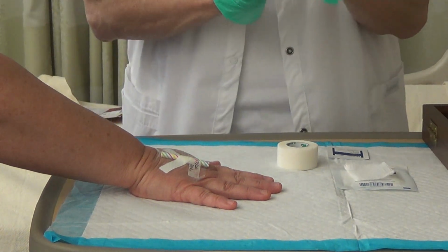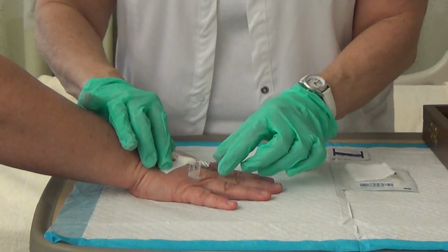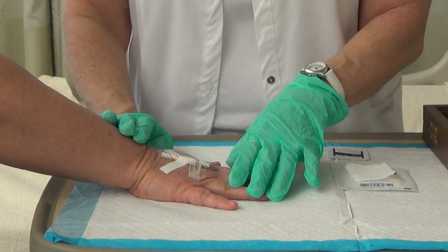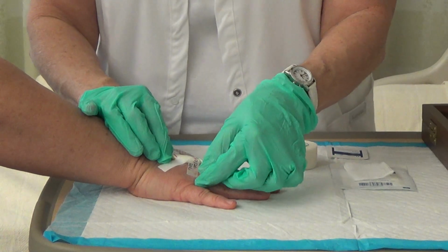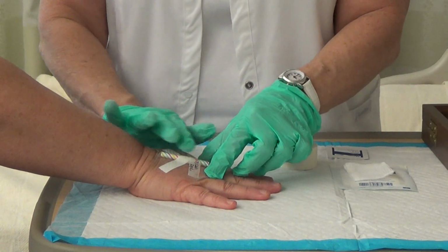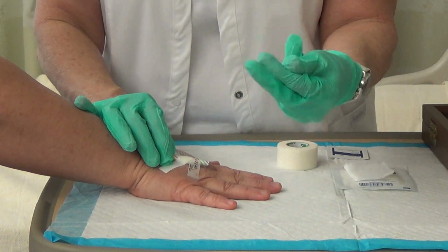And of course explain to the patient what we're doing, and she's excited. She gets to go home. Mrs. Smith, I'm going to go ahead and take your IV out, so you just relax, and I'm going to hold it firmly. Again, we don't want this IV moving around inside the vein. It's plastic, there's no needle in there, but still the plastic can do damage.